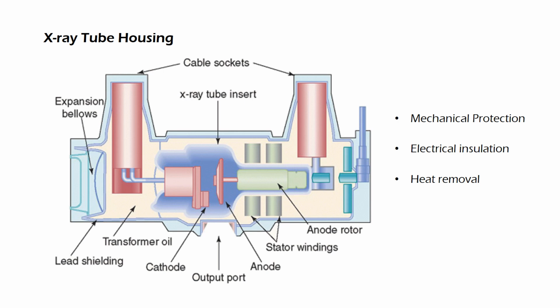The housing also provides radiation shielding to prevent any radiation, except the primary beam, from leaving the housing. The inside of the housing is lined with lead sheets to minimize leakage radiation. The maximum acceptable exposure due to leakage radiation is limited by regulation. Most X-ray tube housings have provision to attach added filter, usually aluminum, on the X-ray output port to absorb the unwanted soft X-rays and minimize patient dose.